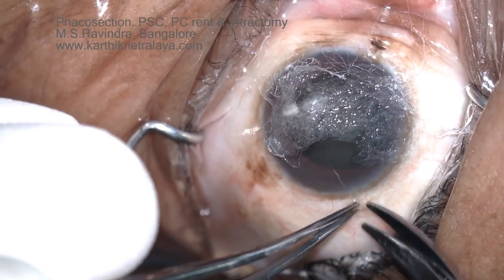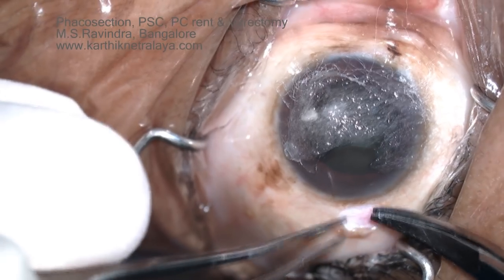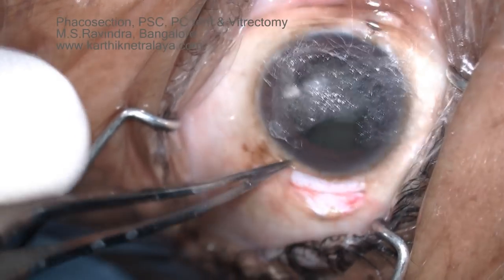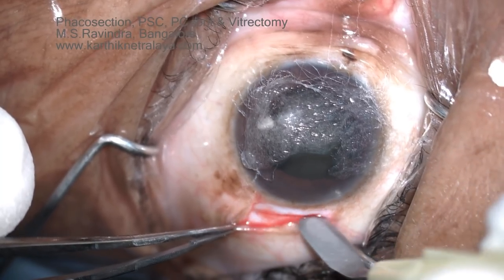A posterior subcapsular cataract in a diabetic patient with significant macular edema is undergoing cataract surgery. A six millimeter long upper temporal quadrant sclerocorneal tunnel is being created.